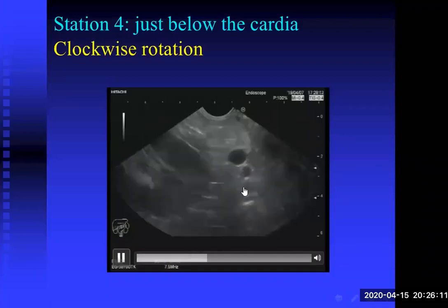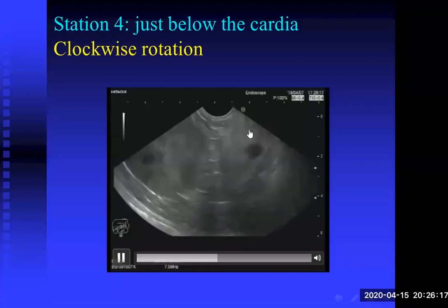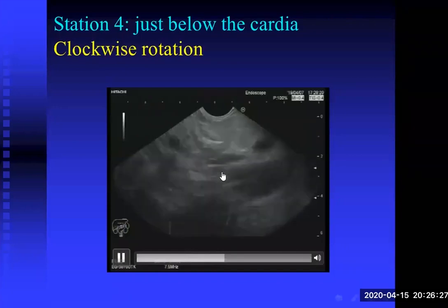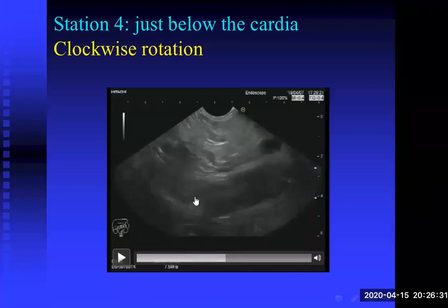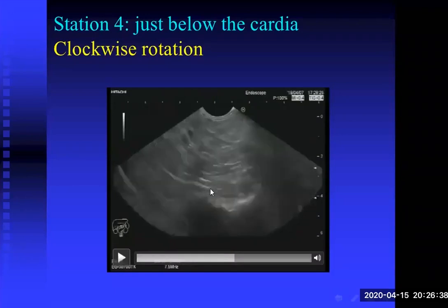Here I can see the left suprarenal gland. This is the region of the pancreatic tail, at the level of the kidney and left suprarenal. This is the anatomical site of the pancreatic tail. Okay, yes, this is very nicely seen, the left suprarenal gland, and this shape is also like the seagull. So this is the fourth seagull which we saw today.